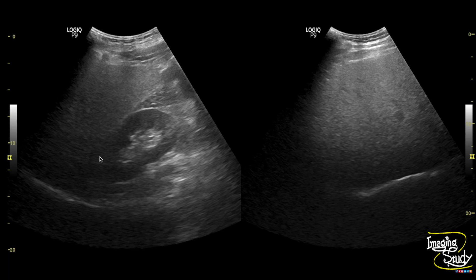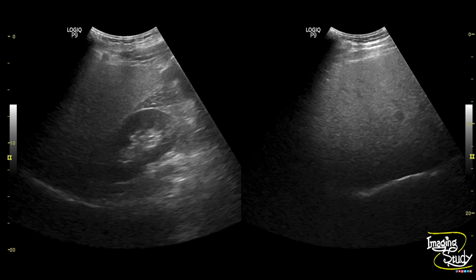On the left, you can see the renal parenchymal echogenicity and hepatic parenchymal echogenicity comparison. You can see the distal part looks darker than the proximal part from the transducer surface, due to increased sound attenuation by the hepatic fatty tissue.